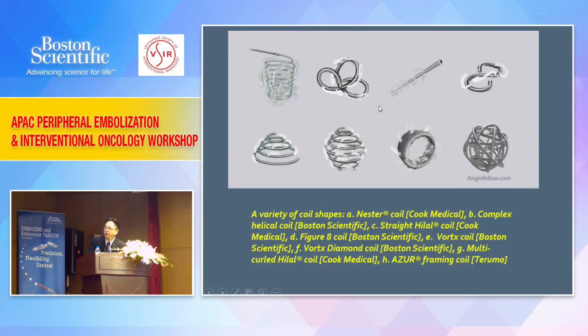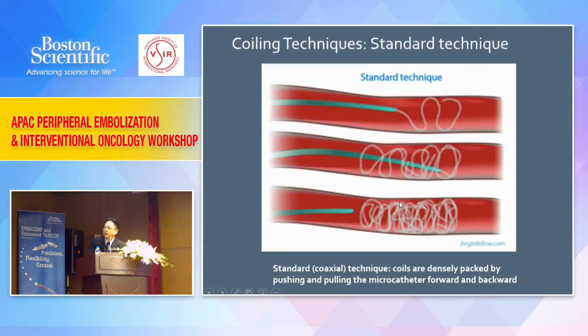Coil, there are many coils. Most of them are pushables, some are detachables, and there are 3 techniques essentially in the deployment of coil inside the vessels. The standard technique is just push it in, right? Make sure the size is appropriate, choose the correct size, push it in, and just drop it there.